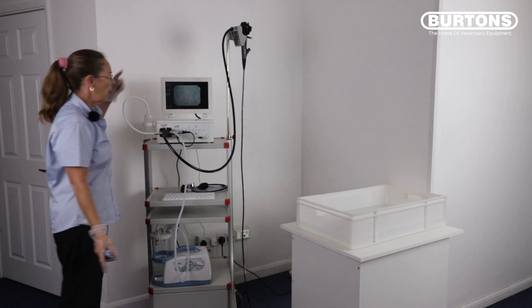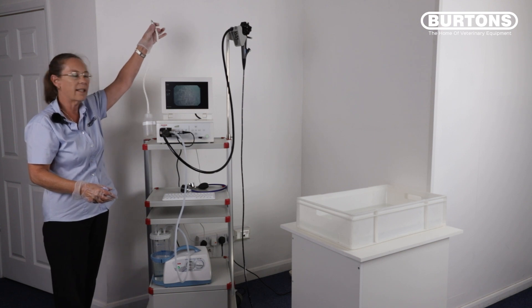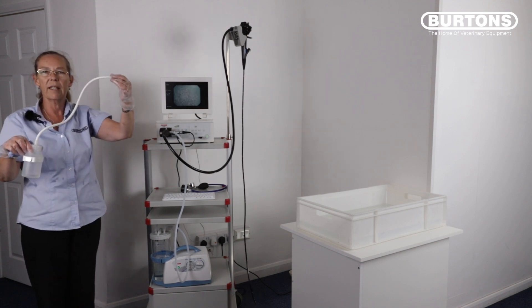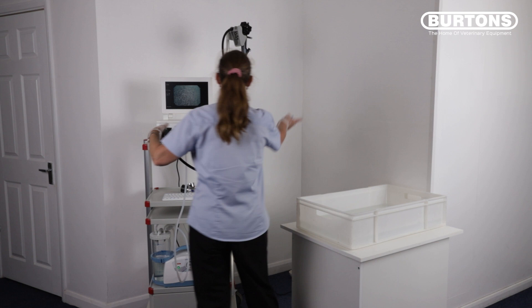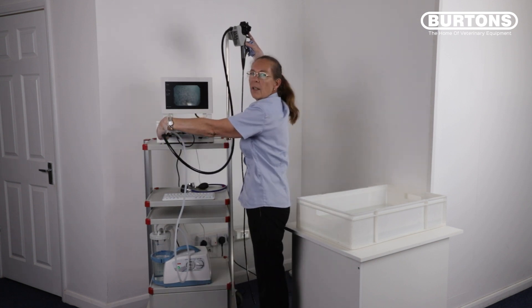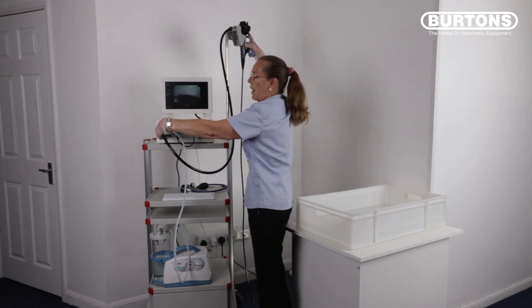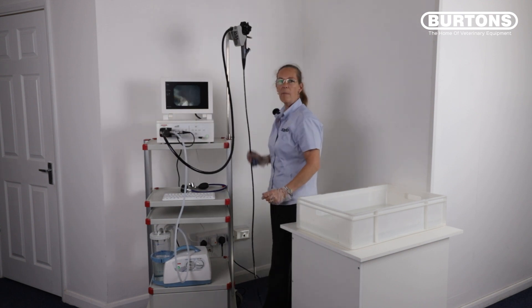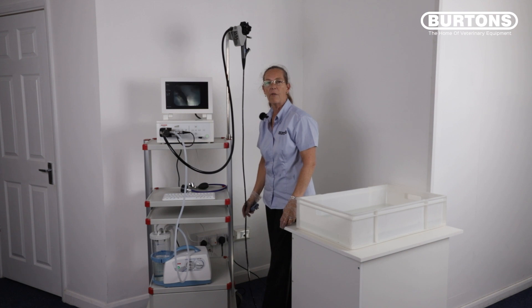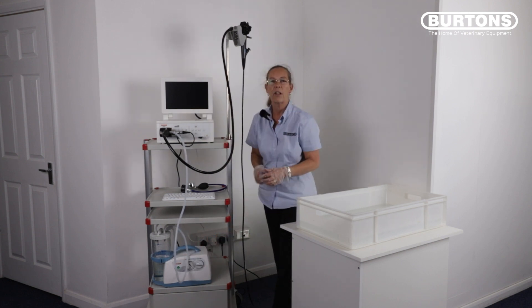With the pump on the light source still turned on, disconnect the water bottle. Be careful that it doesn't anti-siphon — the water bottle can now be cleaned and disinfected. Put your finger over where the water bottle has just been removed from. Cover the blue button to remove any water from the air channel. Press the blue button all the way down with your finger still over the connection to remove any excess water from the water channel. With the scope stored hanging up, any excess fluid that has not been evacuated from the scope will automatically drain. Turn your unit off and turn your suction unit off.